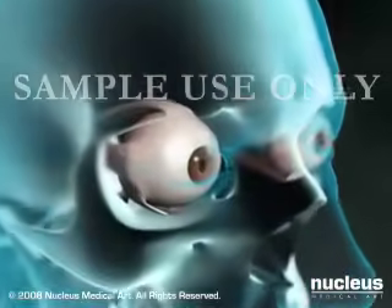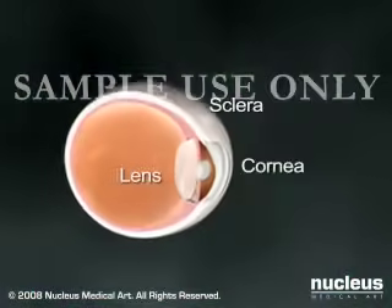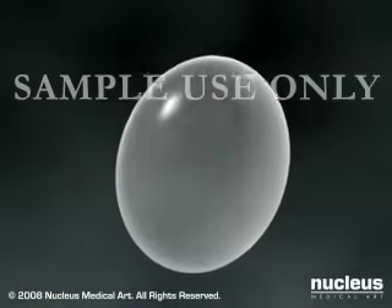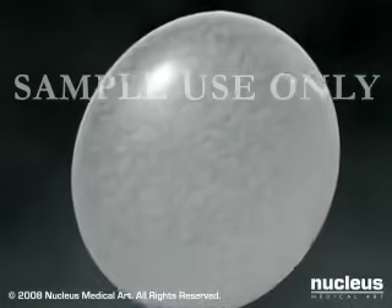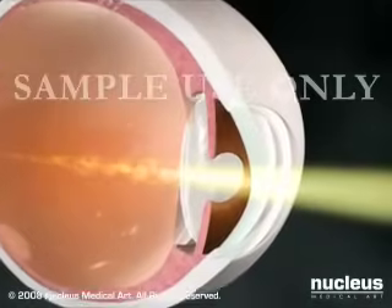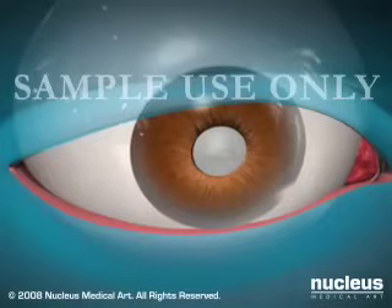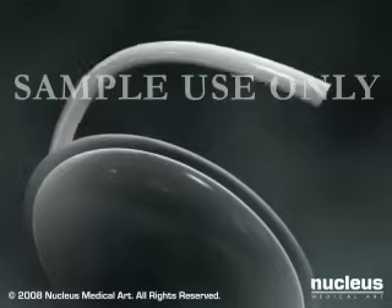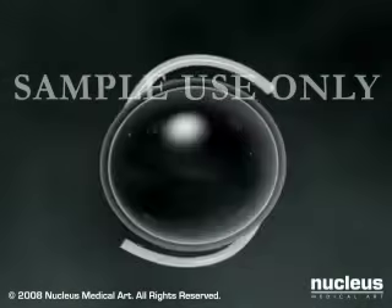The lens of the eye is mainly composed of water and proteins. As we age, these proteins may begin to clump together and cloud the lens. This clouding is called a cataract. Cataract surgery is the removal of the affected lens from the eye and the insertion of an artificial lens.